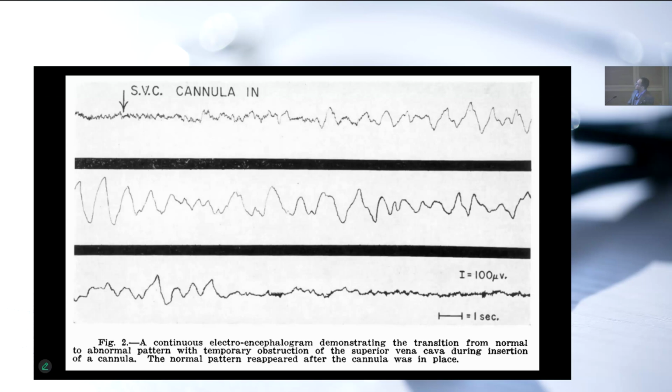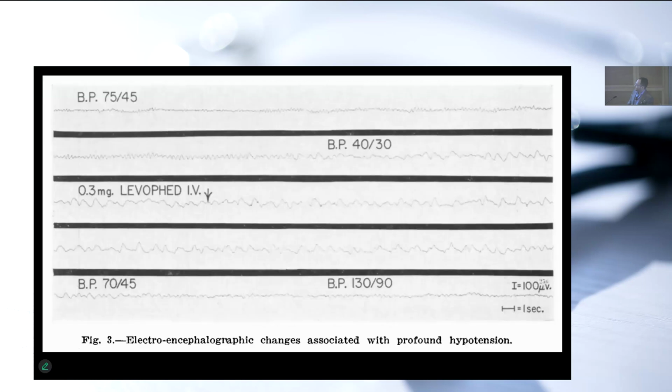This change was, of course, known already. We knew from studies of carotid cross-clamping and from studies in dogs where they had made the dogs anoxic or severely hypotensive, that if you do that, you get this characteristic featureless delta frequency slow wave activity, which is usually reversible if it doesn't go on for long enough. But if you keep this on forever, then that never comes back and you have done some permanent damage.